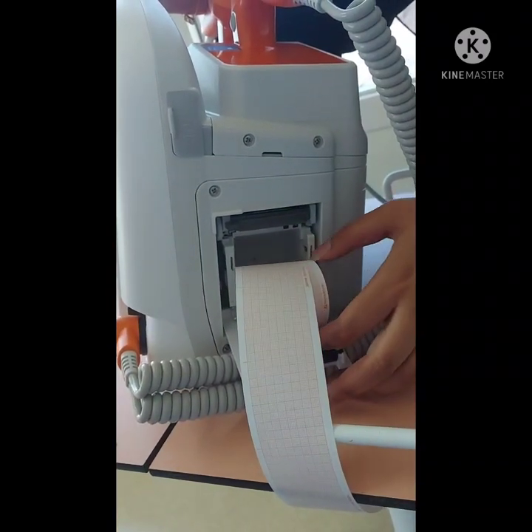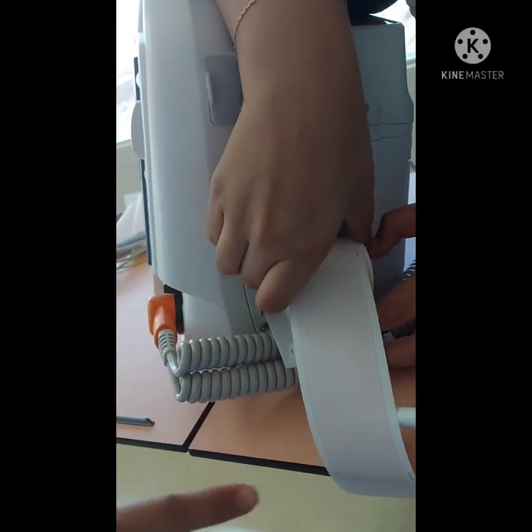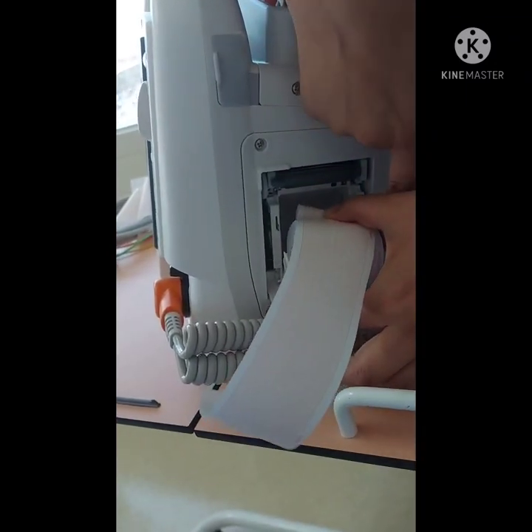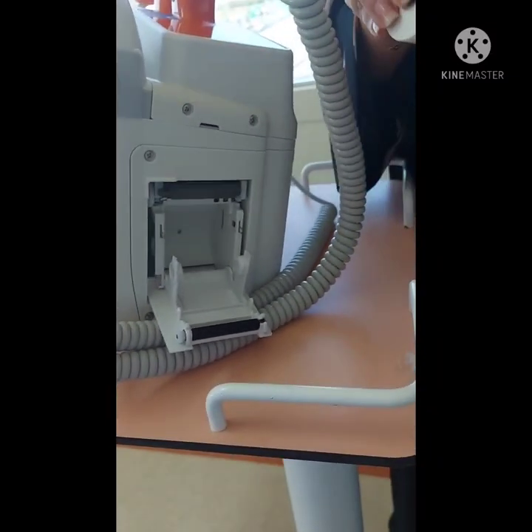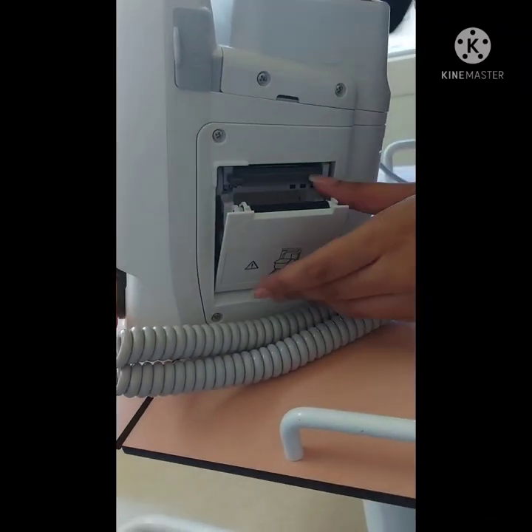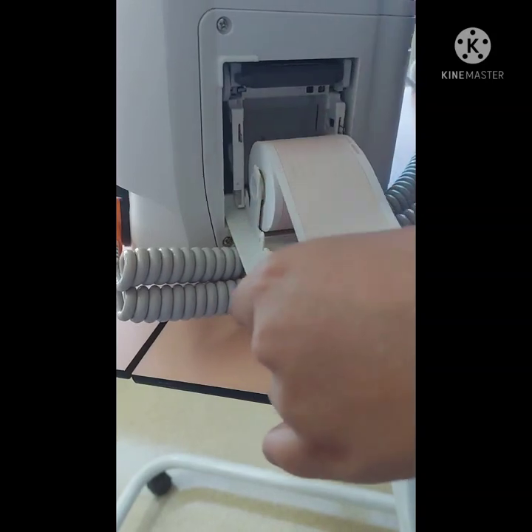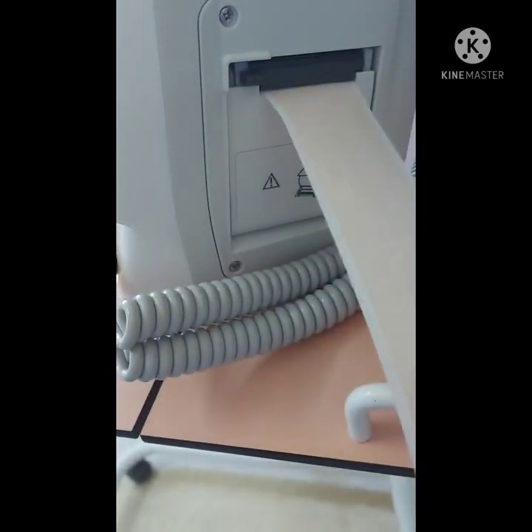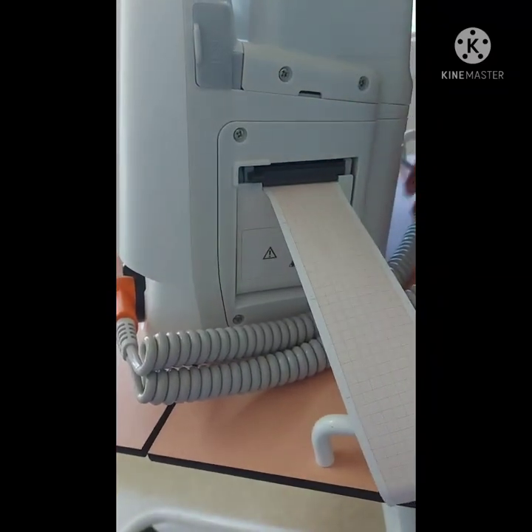The same that we are using. I don't know what paper size you have. Maybe, because otherwise you have to request a new one. It already comes, I think, with three rolls with each device. So you just have to make sure that the orange side is up and the paper is in between these spaces. And it's thermal printed, so you don't have any ink or anything. You just have to put it on the side, then make sure it is in the middle, then just close it. The same line should be there. So from the side, that's it.